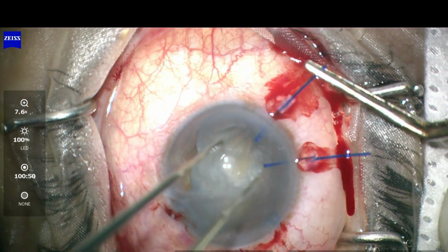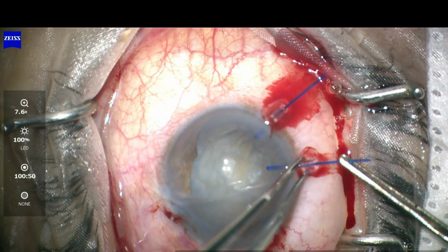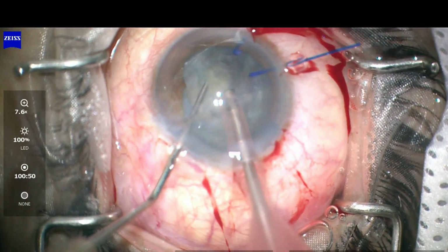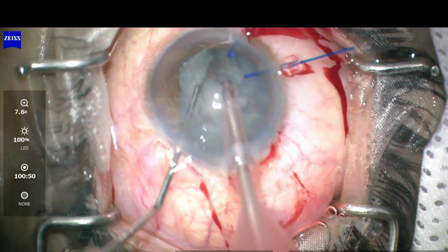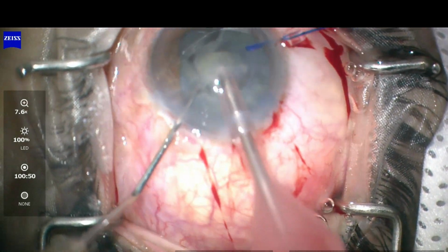Make sure that you don't pull it too much while securing the anterior capsular margin. Next, we can proceed with phacoemulsification. I am doing a vertical chop. Pieces are being slowly chopped and aspirated without causing any zonular stress.